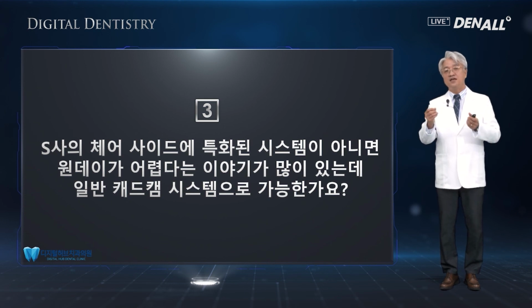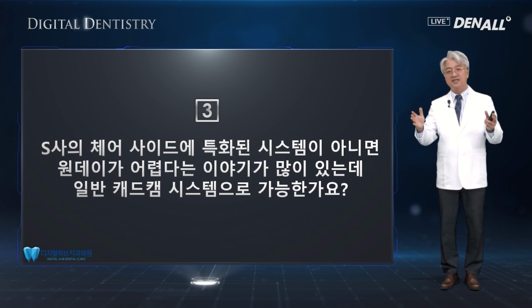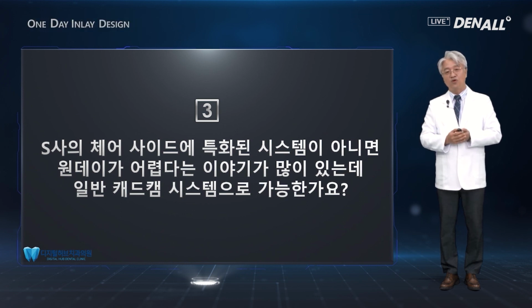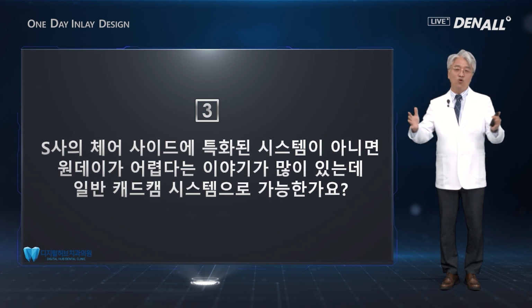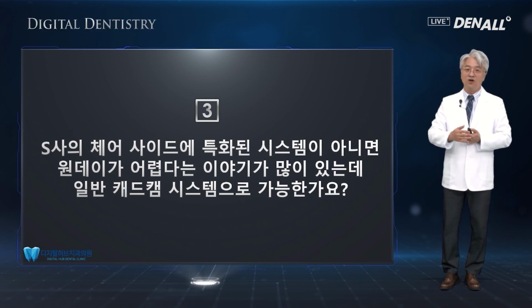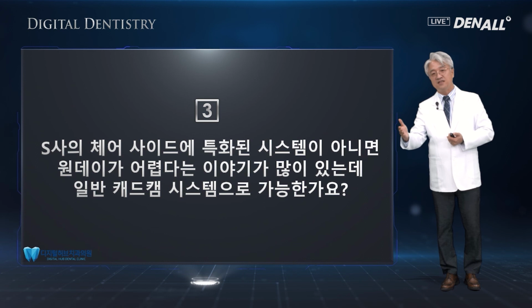This is because milling and design time is very short with this system, so one day was possible. But that chair-side systems, I think disadvantage was that the scalability or expansion in clinical cases were limited, so you cannot have everything, but that made really challenging.